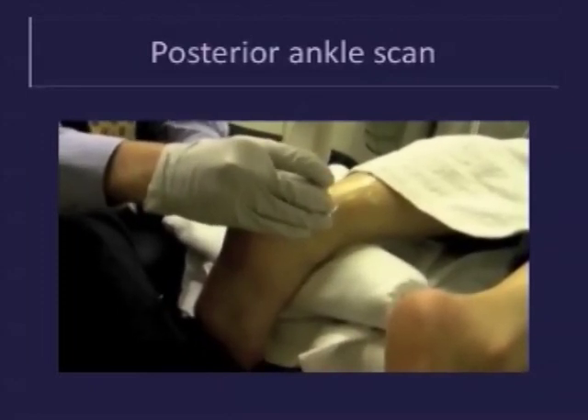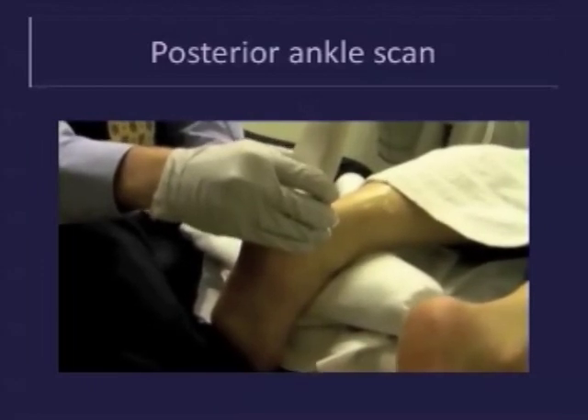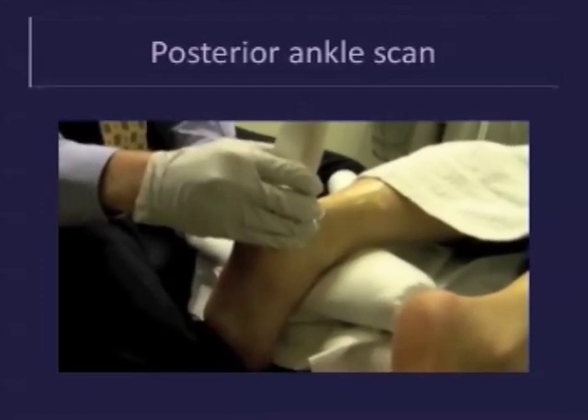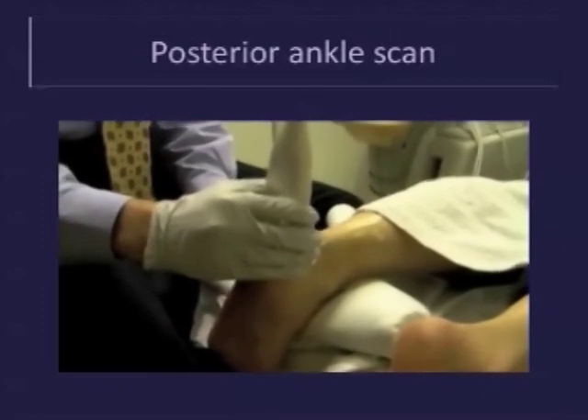Notice that at the attachment, the tendon is hypoechoic. One needs to rock the transducer to get rid of anisotropy. This should be done in both a transverse and long axis plane to differentiate anisotropy from pathology.